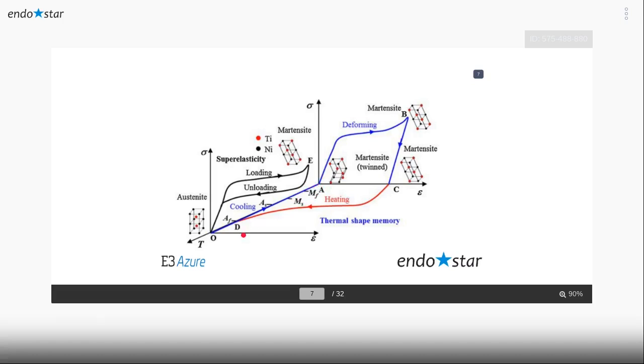So when we produce a file from austenitic parent phase and it's stable in the martensitic phase, and you go and use it inside your tooth, it will undergo deformation. Martensitic already as a matrix is a twinned phase, so it will go under deformation to the detwinned phase. So in this case, the file takes more force and more deformation and still no fracture.